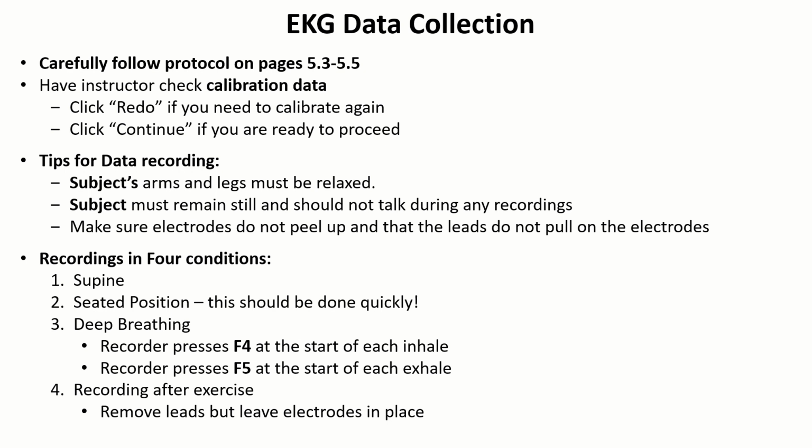So they'll be in the supine position for 5 minutes. You'll obtain that reading. And then as soon as they move to a chair with both feet flat on the floor and they are still, you'll immediately begin to collect more data. So again, the earlier you can do this, the better your data will be. Once you finish this, you'll move on to deep breathing.